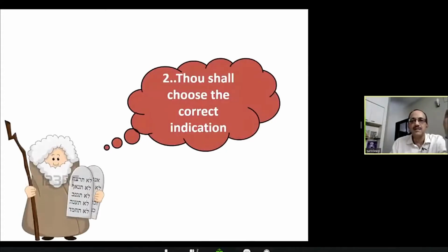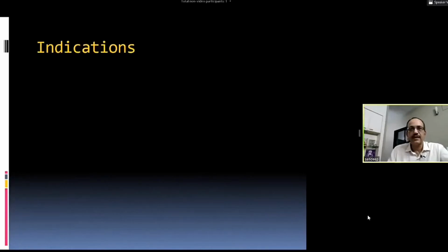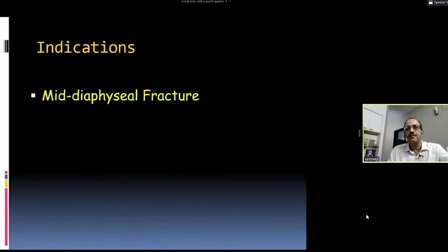The second commandment is thou shalt choose the correct indication, right? You know the tool, but your indication should also be right. So what is the correct indication for elastic nailing? Classical indications for elastic nailing would be a mid-diaphyseal fracture, right?